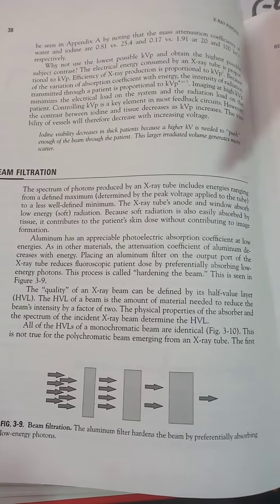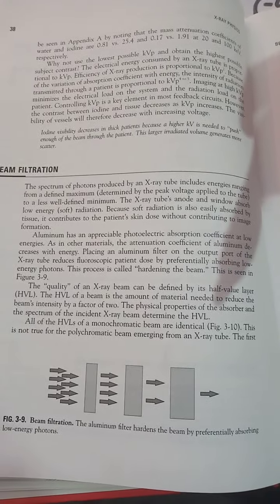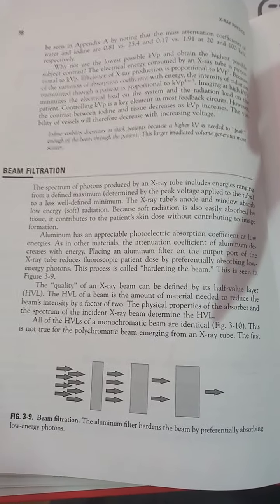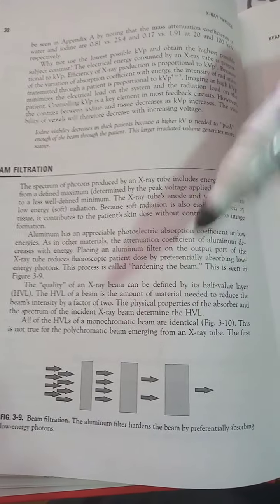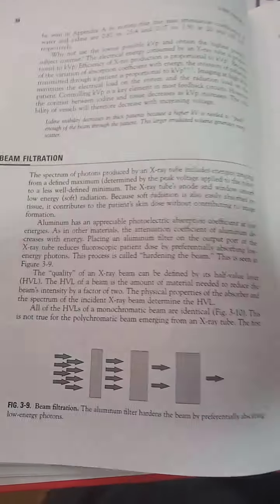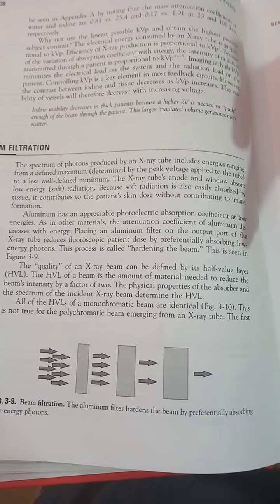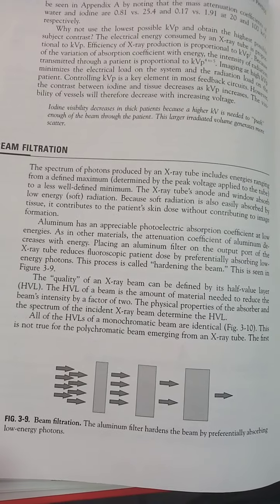The half-value layer of a beam is the amount of material needed to reduce the beam's intensity by a factor of 2. The physical properties of the absorber and the spectrum of the incident X-ray beam determine the half-value layer. We're assuming that all of it is monochromatic, which it isn't in a real X-ray tube. It's polychromatic, and it's coming out from an X-ray anode. It needs to be hardened, collimated, and have its half-value layers sorted out.